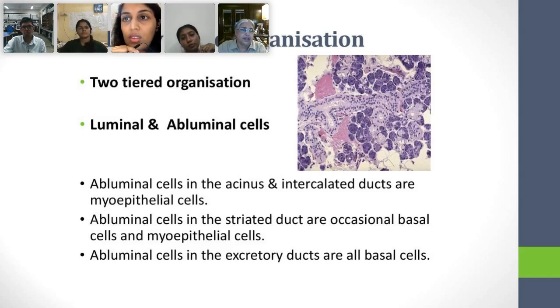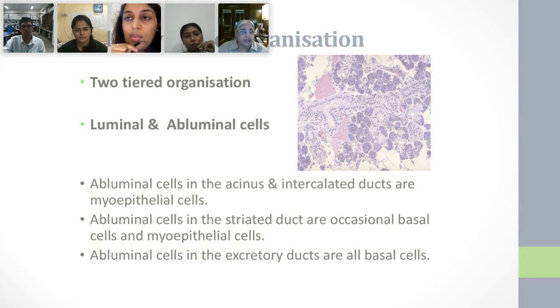Is this a serous gland? Serous. Are you sure? Predominantly, it's serous. It's seromucinous. There is some mucinous component. So if it's a seromucinous gland, which gland is it? Either minor or major, can you see the mucinous component?